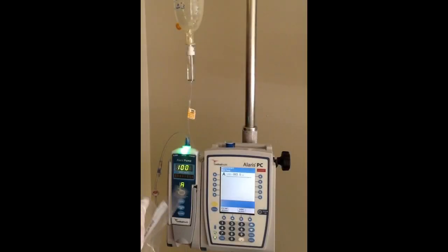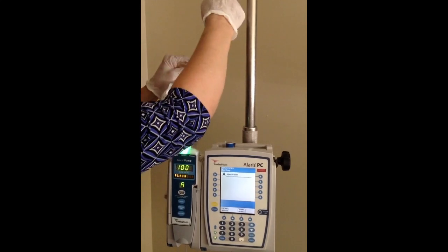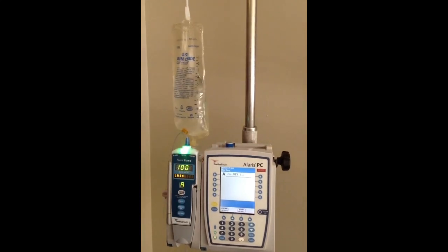To hang our secondary bag, the first step is to take your equipment. One of the pieces of equipment in the bag is your hanger. You want to make sure you drop your primary bag the full length of your hanger, so don't cross it over. Drop it down the full length of that hanger, and then pull out your brand new secondary tubing.